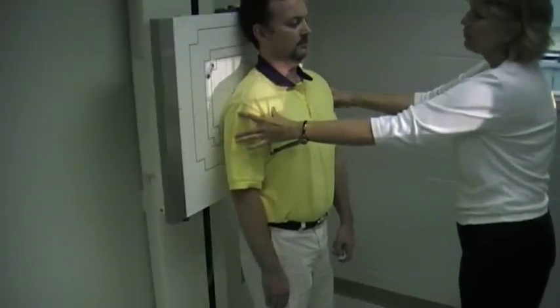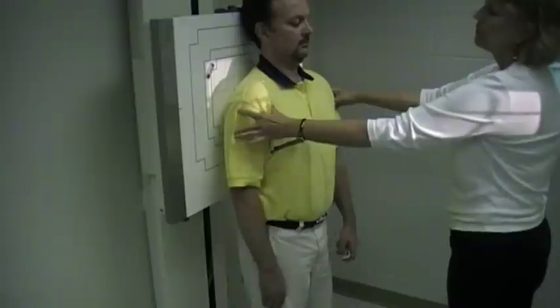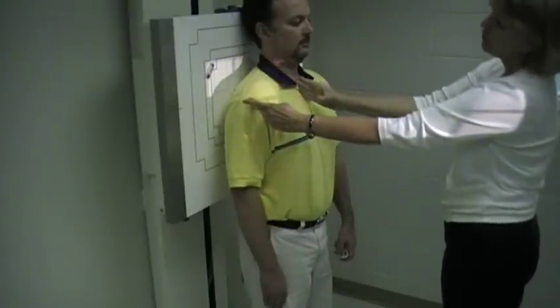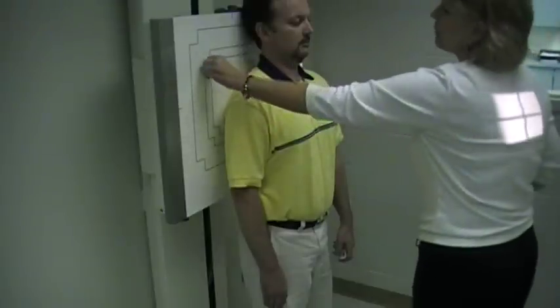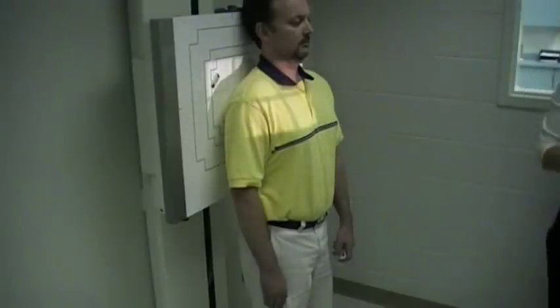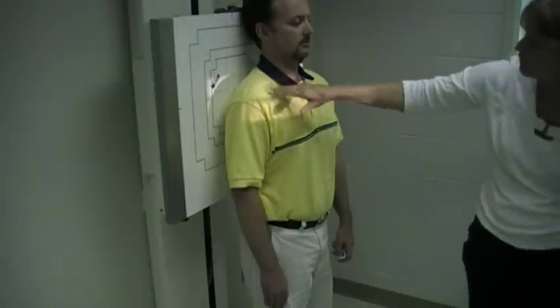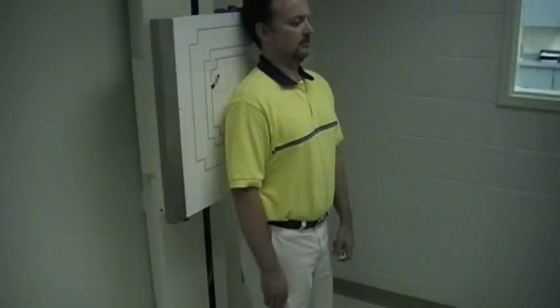So I'm just going to move David just slightly to the side. You want to be sure you include the 2 ends of the extremities of the clavicle as well. So with this projection, I can collimate from top to bottom, because we do not need very much of the chest in. We just need this clavicular area. Okay, so that is our AP clavicle.